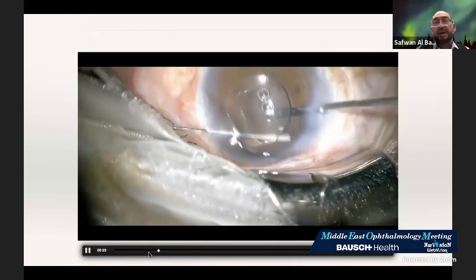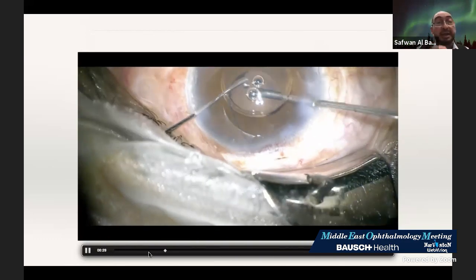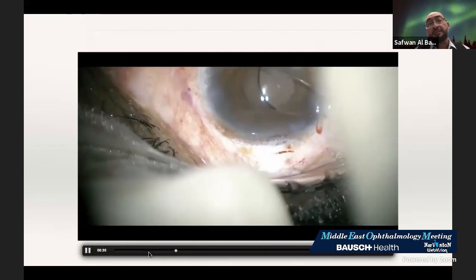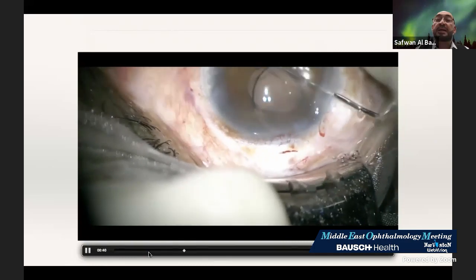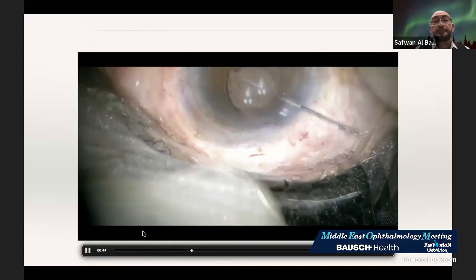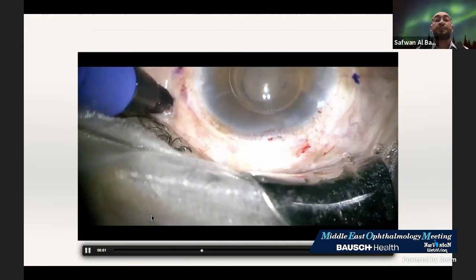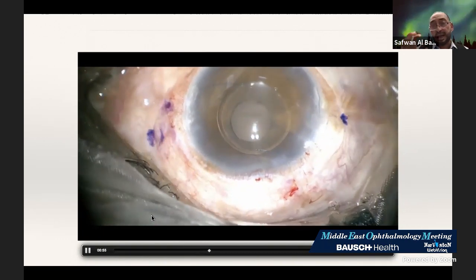I did my vitrectomy. The pupil is small here, so I was scared to touch the pupil, but in one step I used the retractor. But you can see, I returned back to recentering the lens. The leading haptics was up. The marker was 2 millimeters. See, here 2 millimeters, and then 2 millimeters. So I used 2 by 2, but it wasn't clear. Unfortunately, the camera was in the center.